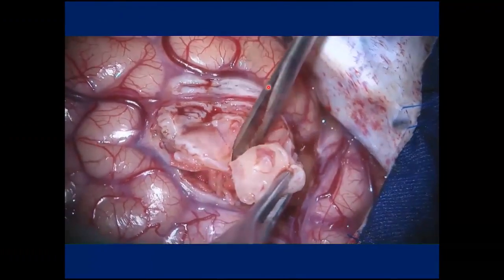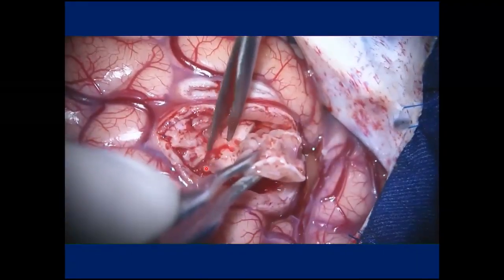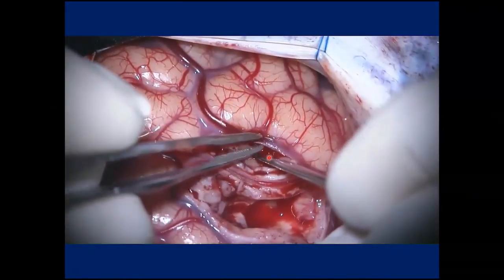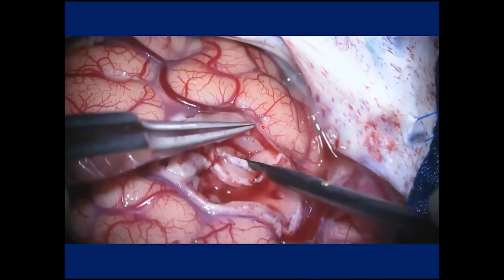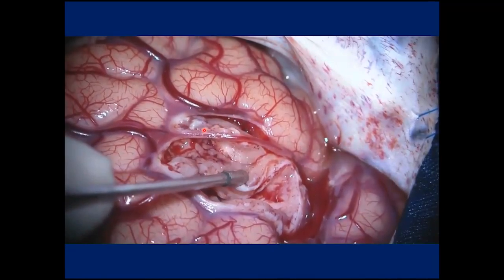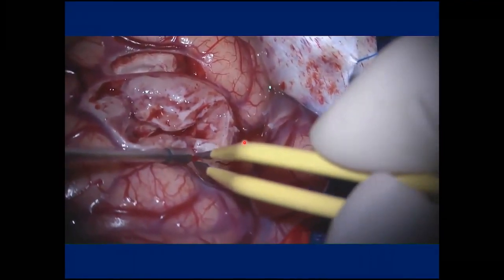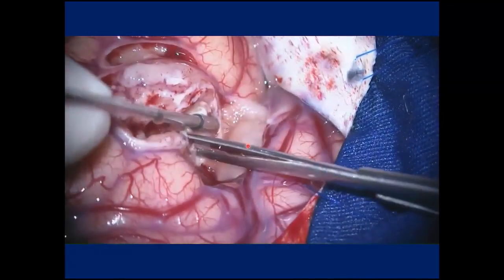Cortical dysplasia is essentially gray matter. You can see the gray matter here. In general, it's very hard. This is what we call a sub-pial technique. I'm peeling the brain off the sulcus over here. Why this kind of technique? Because by peeling the brain off the arachnoid, you are keeping the veins and the small arteries inside the sulcus intact. You don't open the sulcus. So this is a very safe technique.